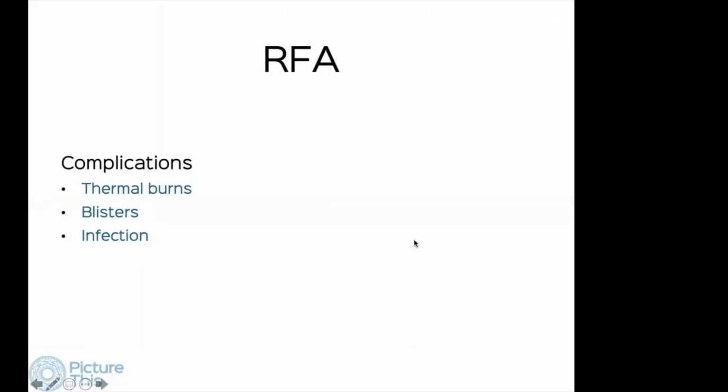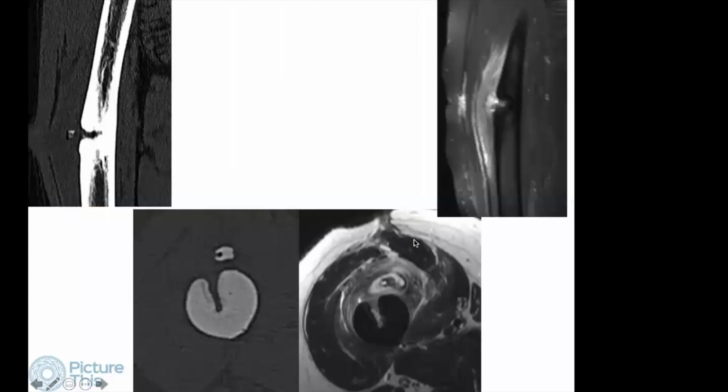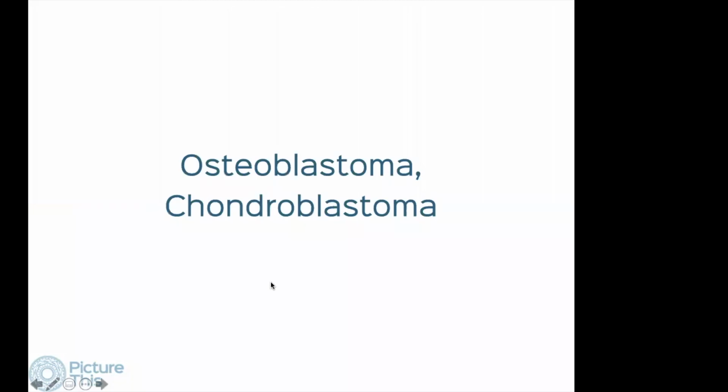get them anymore. Infection, this was one patient, and we still don't know how this happened, where this was the defect and the patient landed up with some sequestrum, and this just kept going on. But this is the only case in the last 480 patients that we've ablated who's had infection.